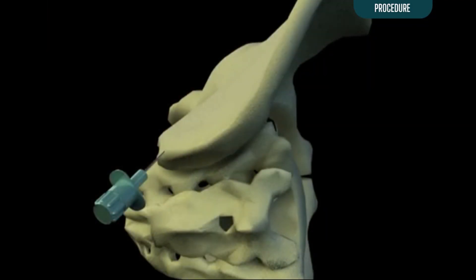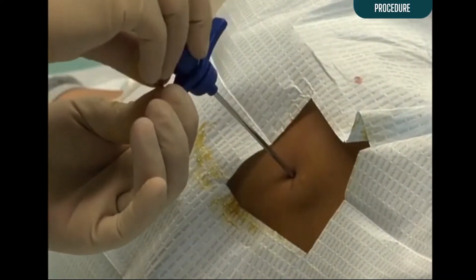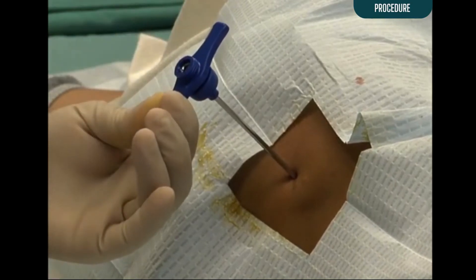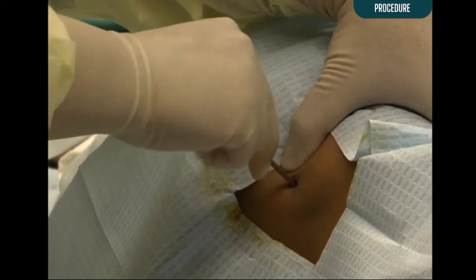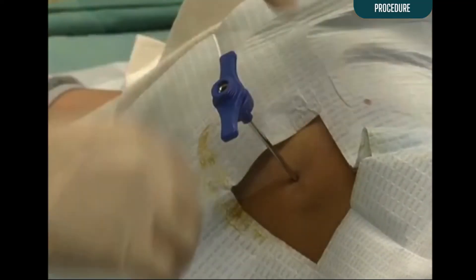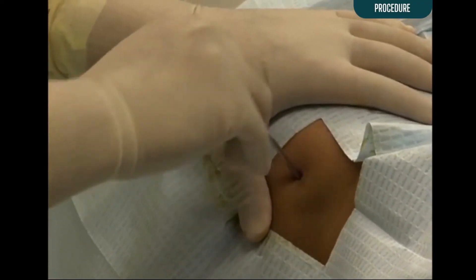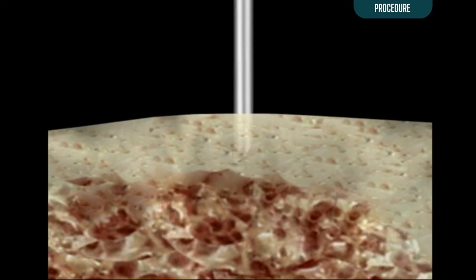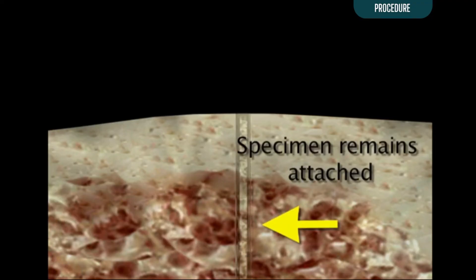The biopsy needle should be inserted into bone at a slightly different angle than a previously performed aspiration. Once the needle is anchored in bone, remove the stylet. Continue to advance the needle one to two centimeters into the marrow cavity with a back and forth rotating motion. The stylet may be reinserted to determine the length of the biopsy specimen in the needle. In order to remove the biopsy specimen, it must be detached from surrounding marrow and bone. Do not pull the needle straight out, as doing so may allow the specimen to remain attached to surrounding marrow and prevent it from being removed in the needle.